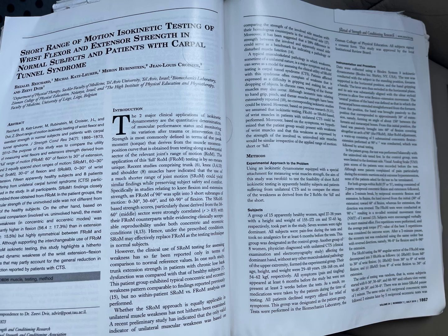Subjects were encouraged verbally to exert maximal effort. 5 repetitions were performed, and the average peak torque, PT, value of the best 3 repetitions was considered the outcome score. After a 2-minute pause, the eccentric test was conducted using the same order, but with reversed directions, namely 90 to 0 for flexion and 0 to 90 for extension.